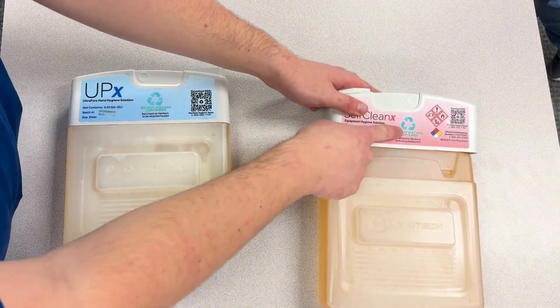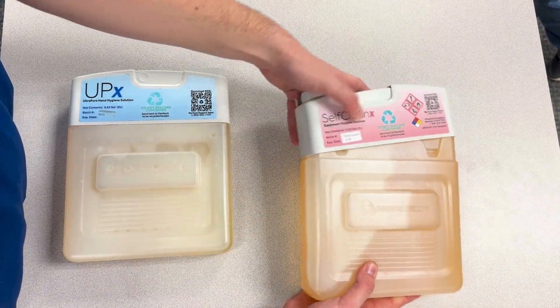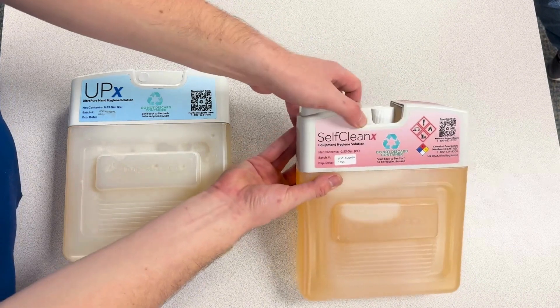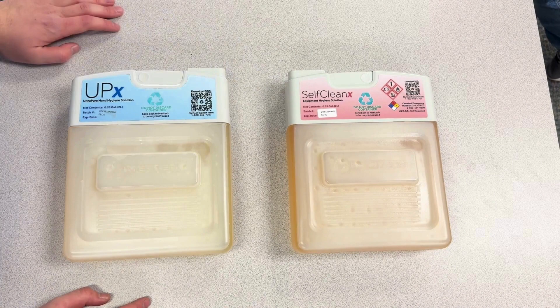Reinstall it with the recycle sign and QR code facing the same way as the Meritec label on the cartridge. Then quickly check that it opens and closes, and now I have replaced my cartridge tops on both cartridges.